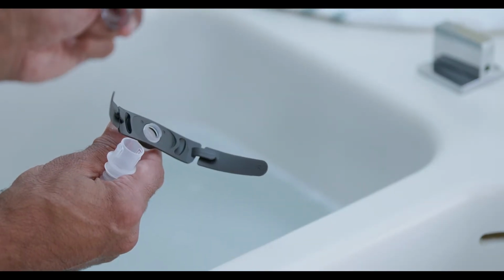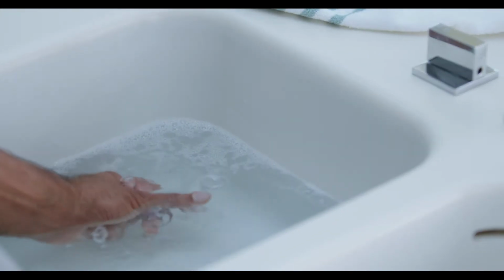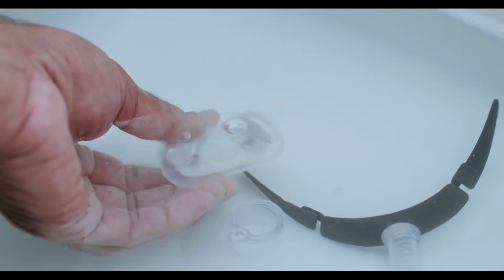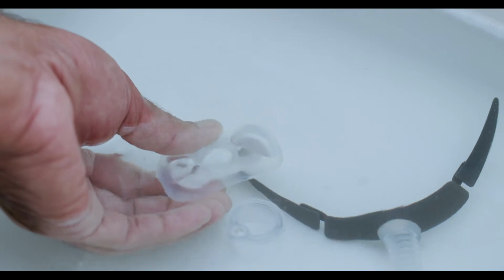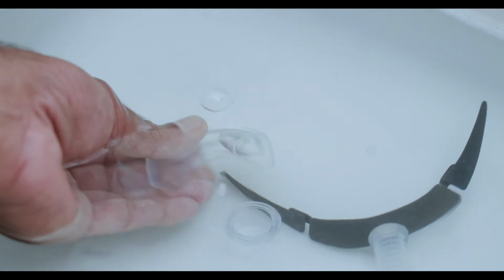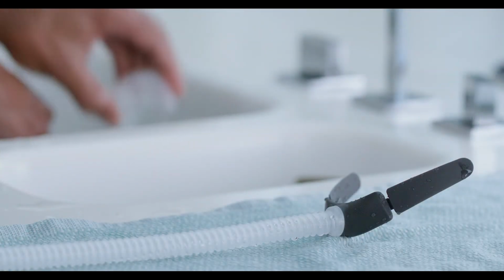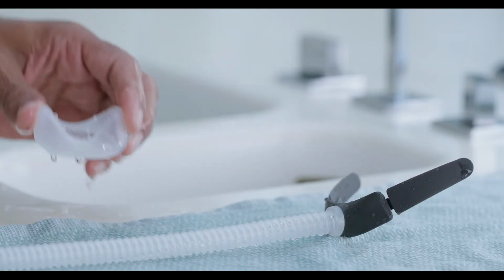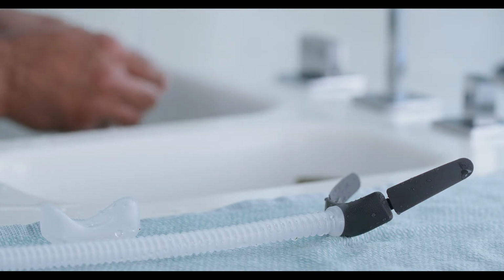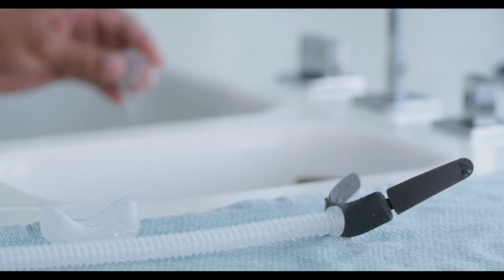Hand wash the non-fabric parts of your mask daily, the cushion, frame, and tubing quick release, with mild liquid dishwashing detergent. Fully submerge the parts in warm, soapy water so that no air pockets remain. Rinse them thoroughly under running water and let them air dry completely.